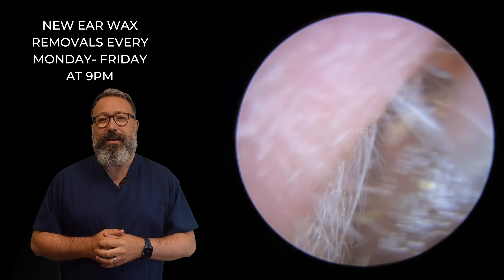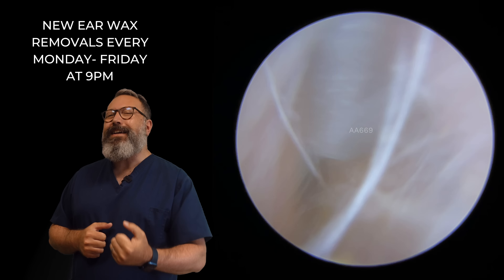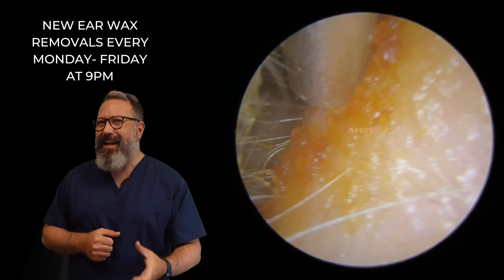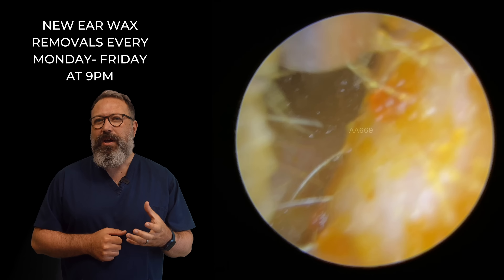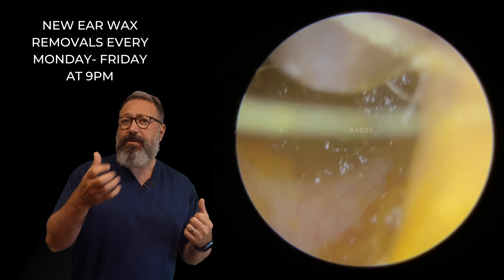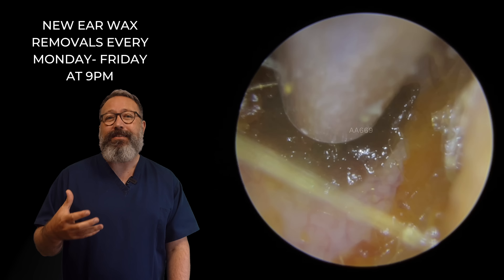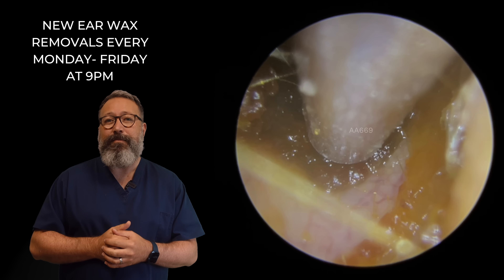There we go. You can see another chunky piece coming out there. Look at the colour of it — it's almost black in colour. And this wax isn't that old; it's only about six months old. So we talk a lot about darker wax being older wax, but it's not always the case. Sometimes patients will produce a much darker type of wax, and that's exactly what's happening here.